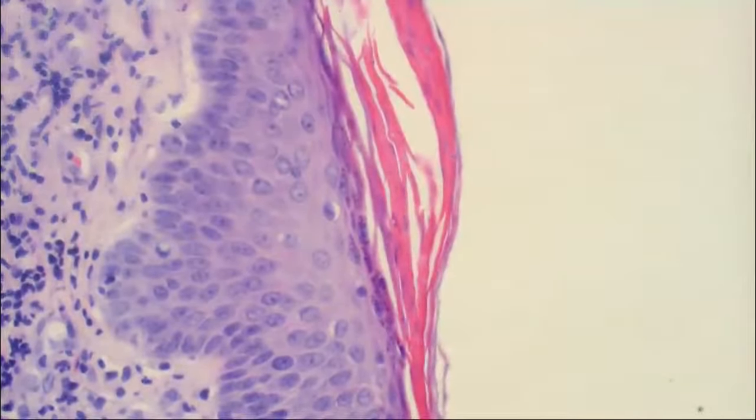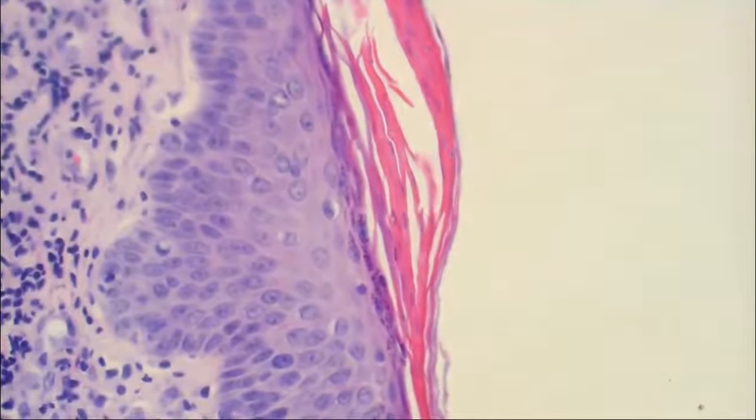So did you think that when you looked at it yourself, or did you just let me show you the alien life forms? No, I thought it was tinea. I didn't stop to think if it was candida. Good. Perfect.